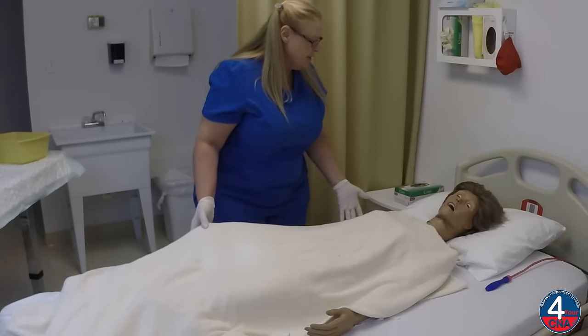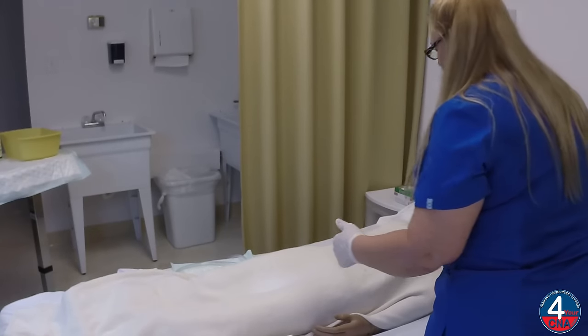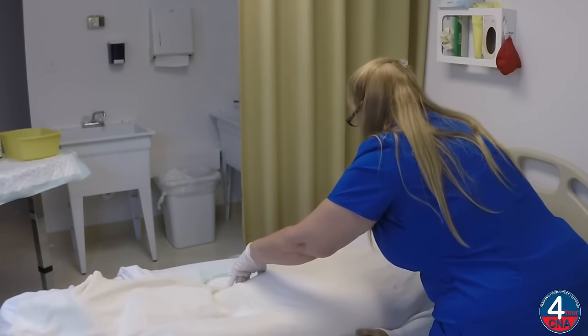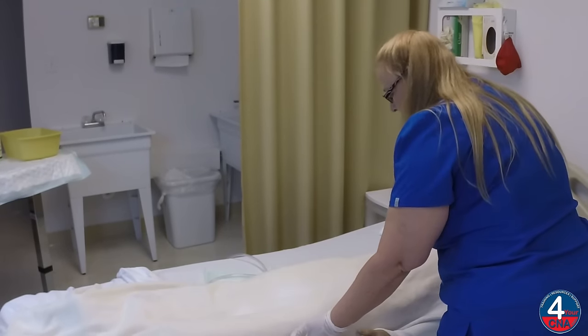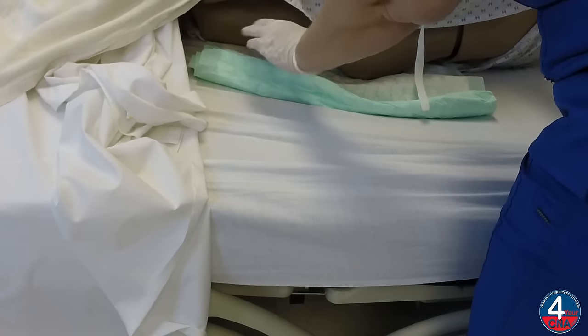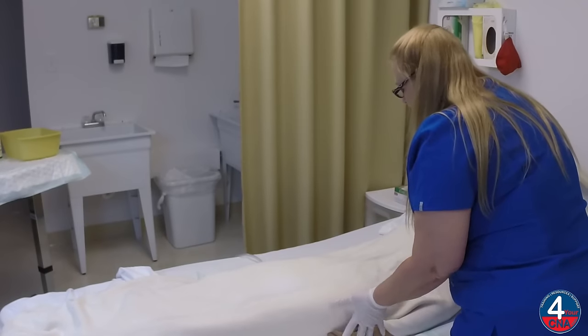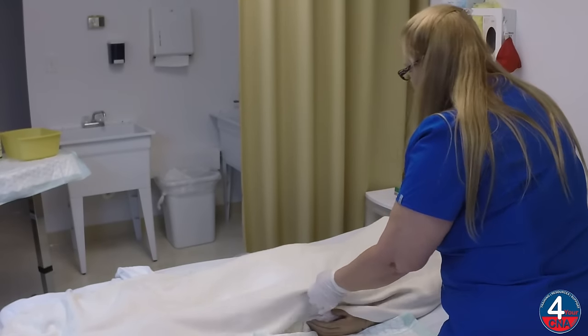Ms. Jones, can you scoot to the middle of the bed, please? Thank you. Ms. Jones, can you scoot toward me? Thank you, and roll up onto your right side. One, two, three. And now I can unroll the chucks to protect the bed. Come on back, Ms. Jones, and scoot to the middle of the bed. Thank you very much.